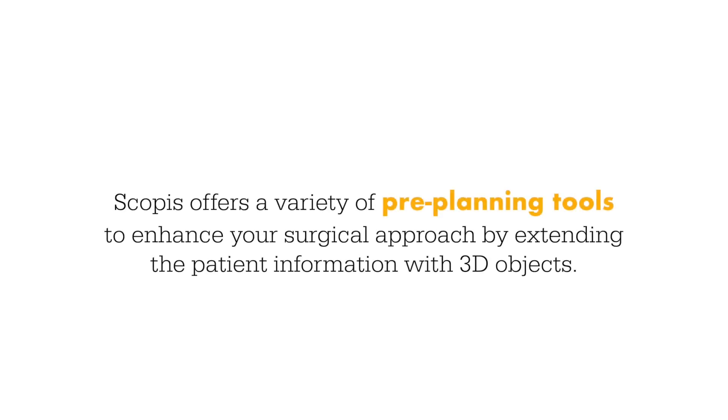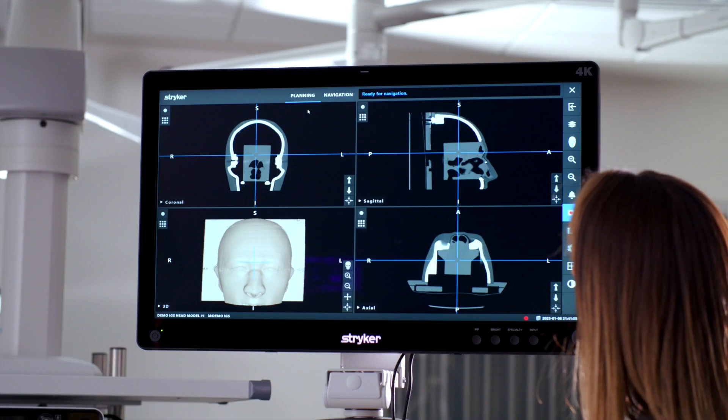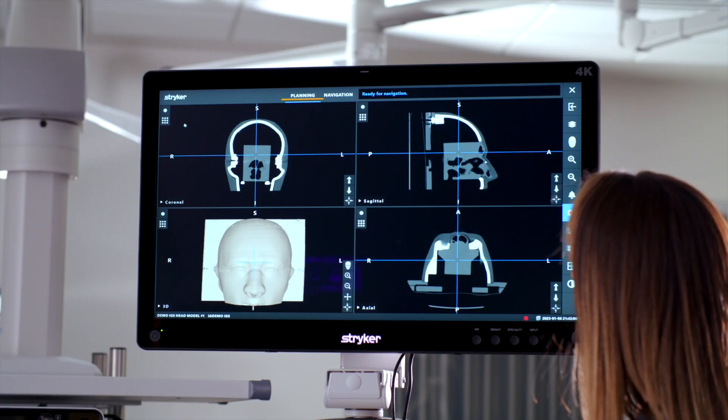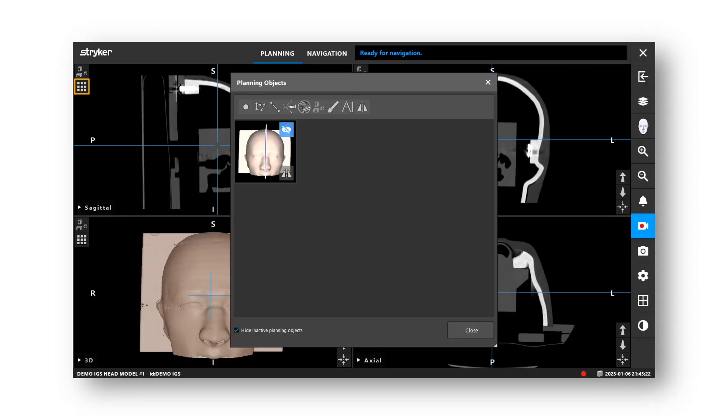Scopis offers a variety of pre-planning tools to enhance your surgical approach by extending the patient information with 3D objects. To access these tools, make sure Scopis is in planning mode, then click on the planning object dialog in the upper left-hand corner of any one of your views.